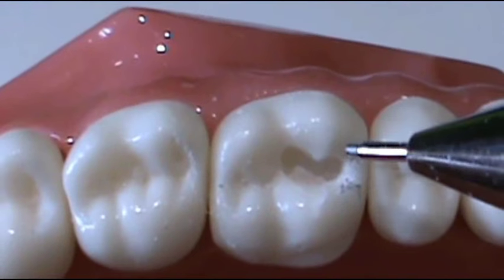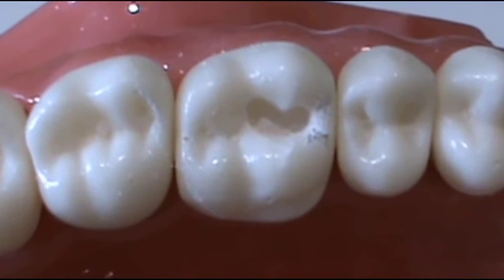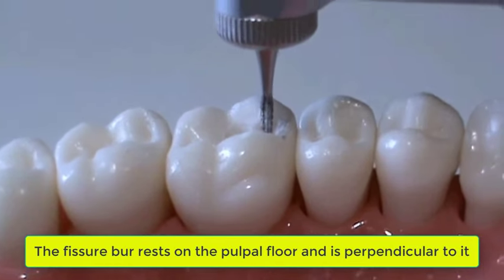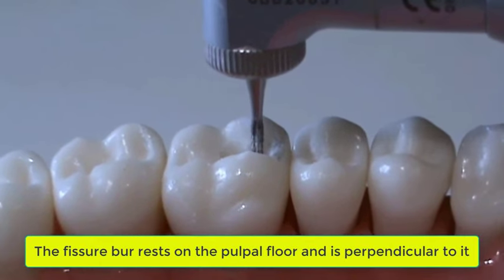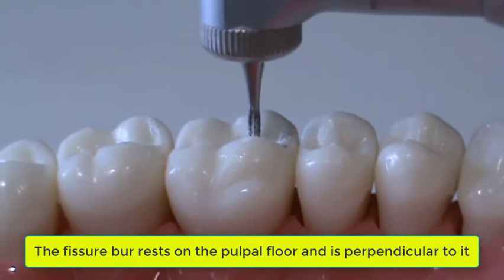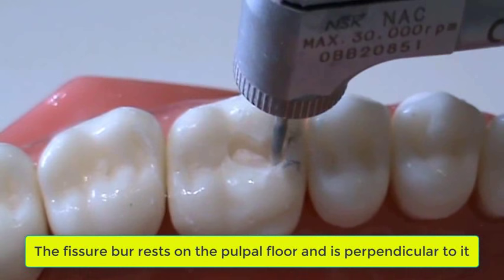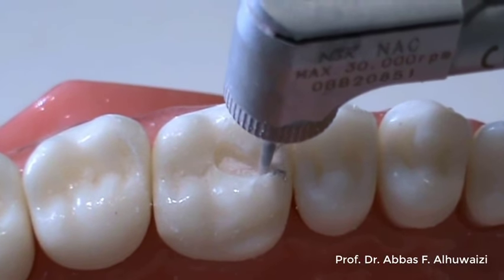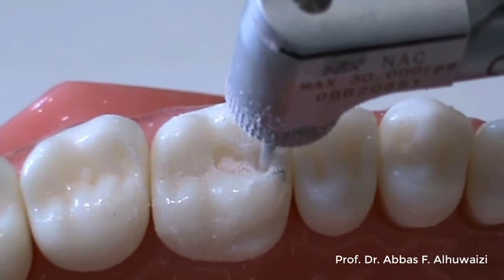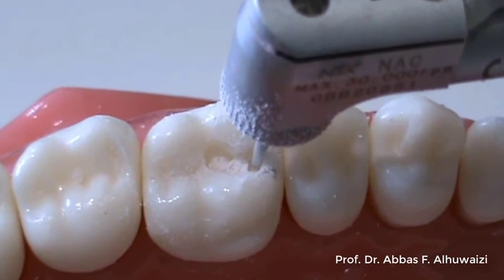Step 5: The Mesial Marginal Ridge must be addressed. This is done by placing the Fissure Burr at the pulpal floor and moving the handpiece mesially. Step 6: Cut from the Mesial Marginal Ridge, making it thinner.